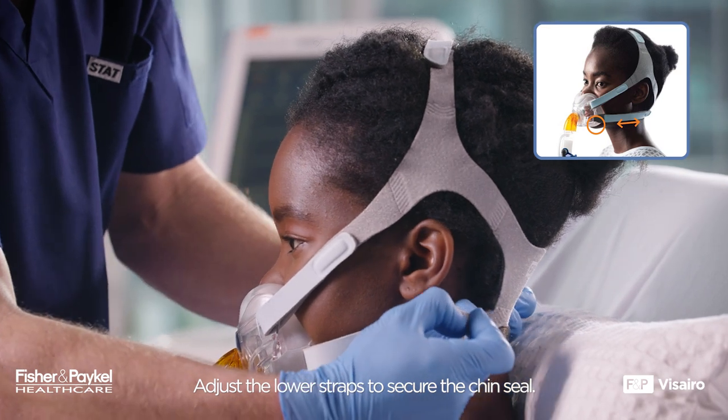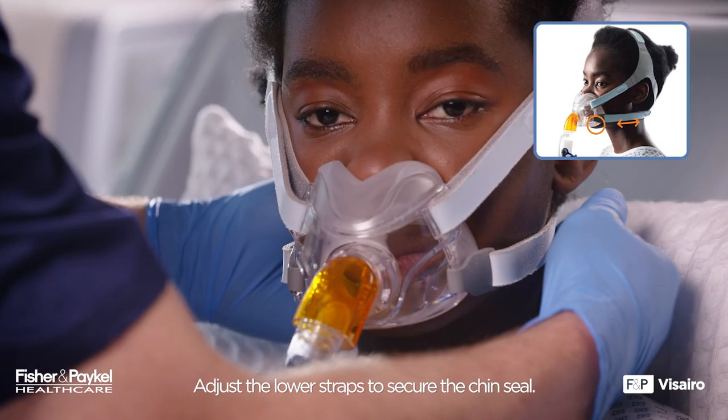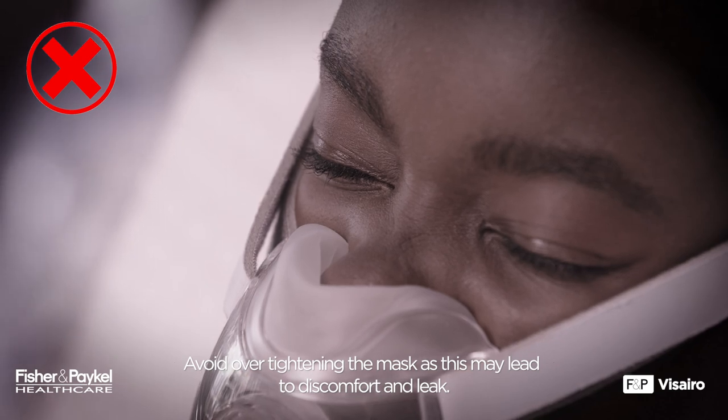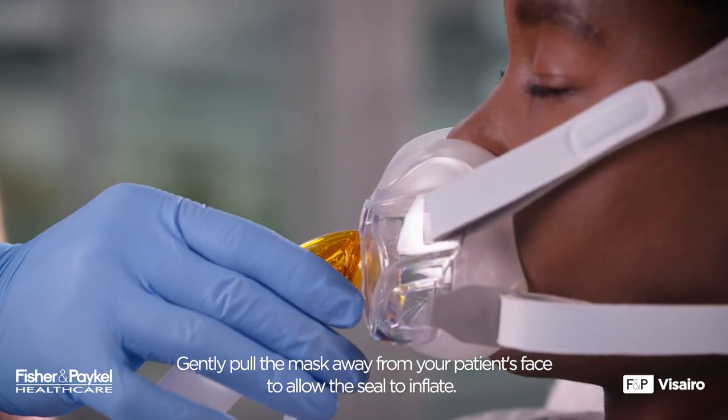Adjust the lower straps to secure the chin seal. Avoid over-tightening the mask as this may lead to discomfort and leak. Gently pull the mask away from your patient's face to allow the seal to inflate.